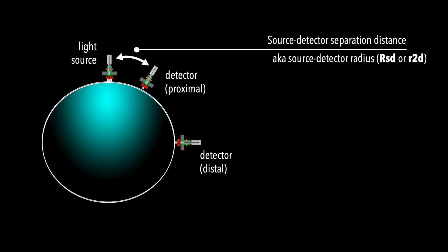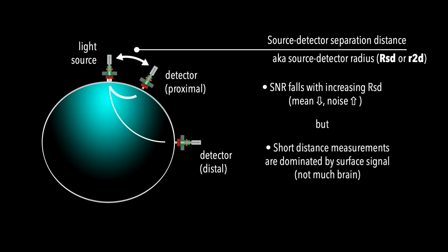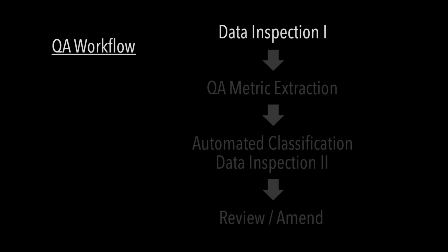Measurements provided by a more distal detector tend to exhibit decreased signal-to-noise because the light must traverse a longer path inside the tissue. Measurements provided by a proximal detector typically have better relative signal-to-noise ratio, but interrogation of the tissue may be poor because the light primarily remains close to the surface. Details may be found in the PowerPoint tutorial on image reconstruction. This trade-off is exploited by NeuroDOT to construct useful quantitative QA metrics as well as qualitative QA summaries, as will be demonstrated later in this tutorial.